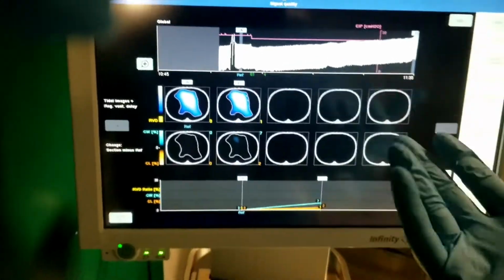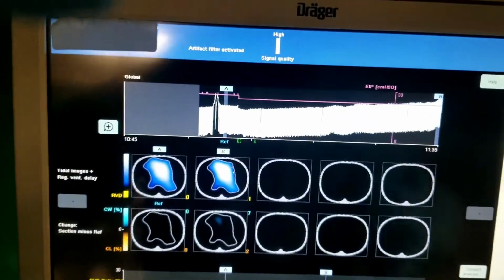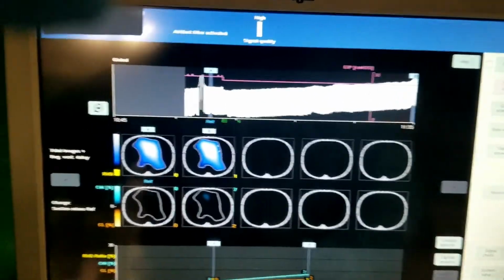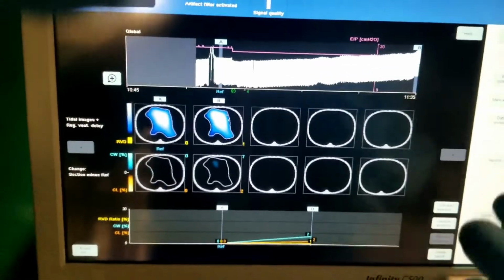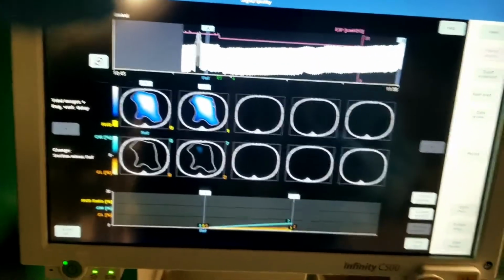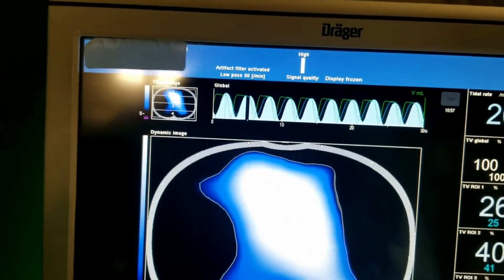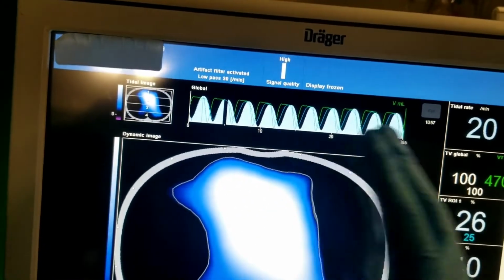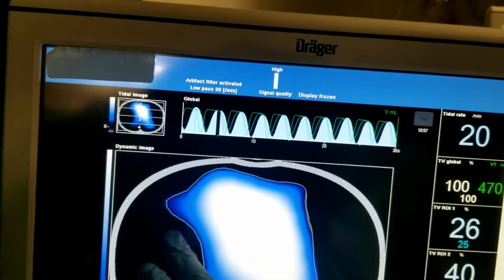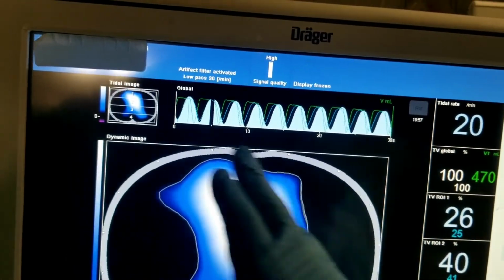So we have three ways that we verified the adjustment on APRV. Using end inspiratory trends, using end expiratory tidal volumes, using regional compliance percentages. So this is the proper way how to individualize mechanical ventilation. One thing also is the blue here starts appearing when there's more than 10% of ventilation being distributed to that region, okay? As more percentages increase, you'll see this white saturation.